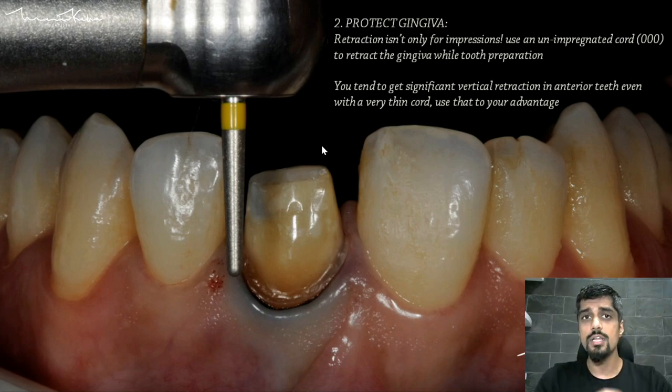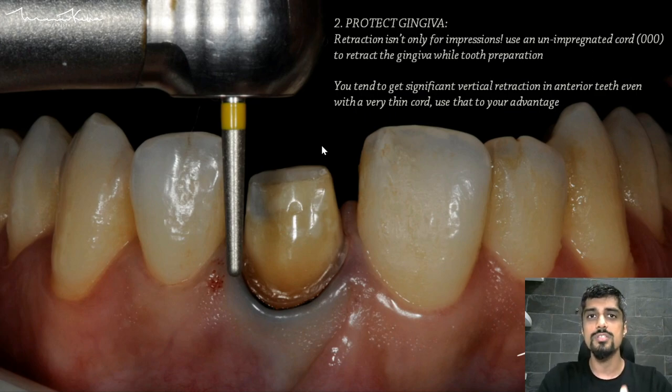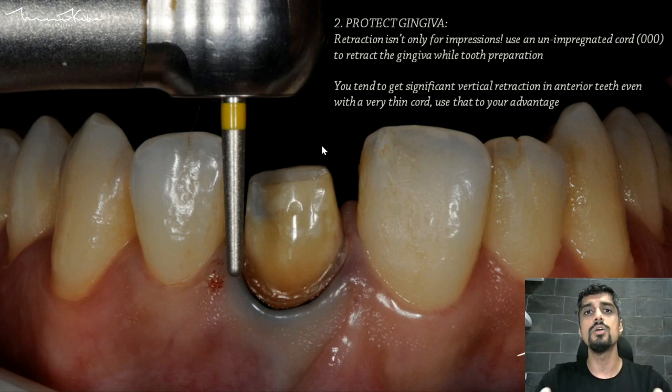In the anterior region, when you have a significant amount of vertical retraction even with a very thin retraction cord, you can end up looking at a sub-gingival margin as if it is a supra-gingival margin while you are doing tooth preparation. This is very, very advantageous because now sub-gingival margins have become supra-gingival.